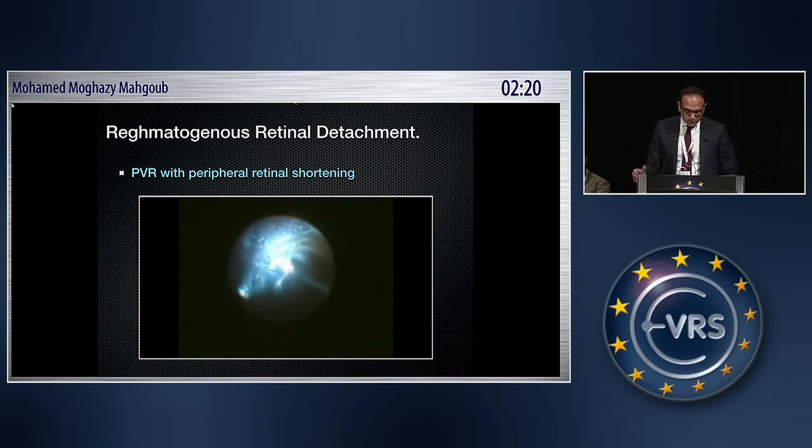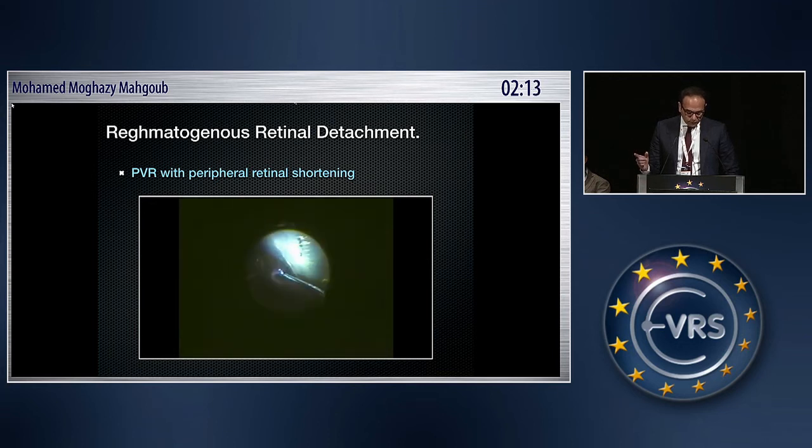This is a patient with PVR with peripheral retinal shortening. After extensive core vitrectomy and removal of as much vitreous as possible, you can use a peripheral break to delineate the area of retinal shortening where the air will go under the retina in that area. You can then cut the retina as necessary, and finally use PFCL to flatten the retina and drain the subretinal fluid.